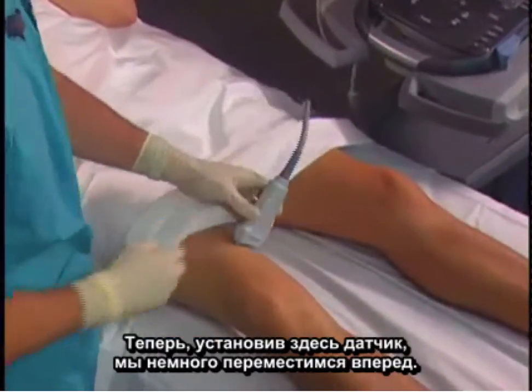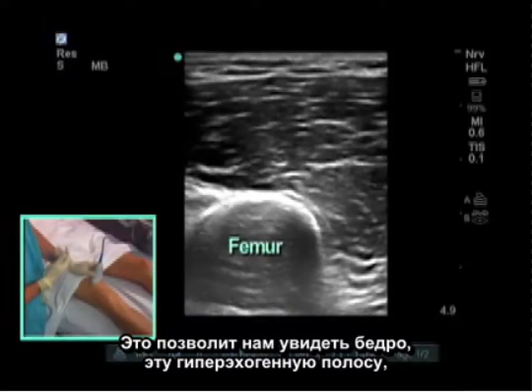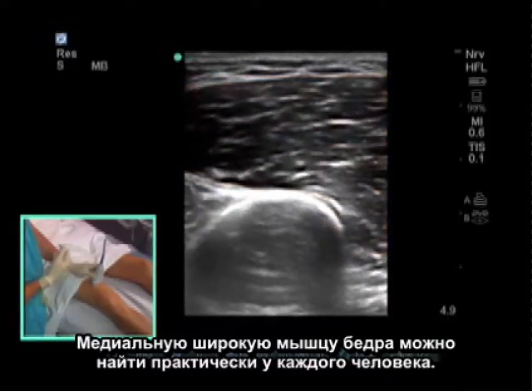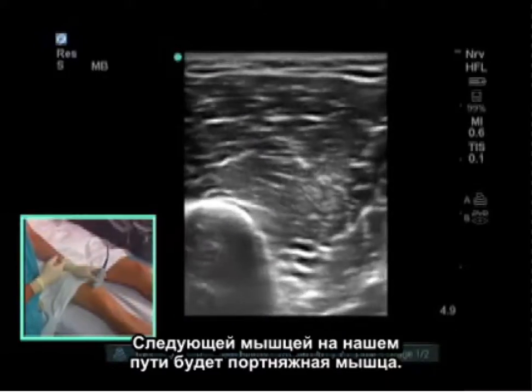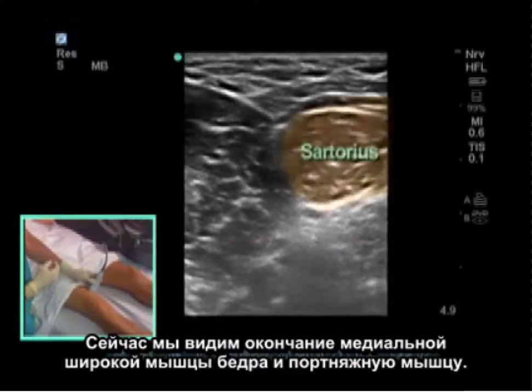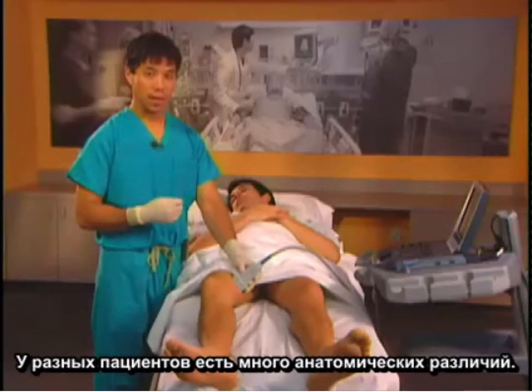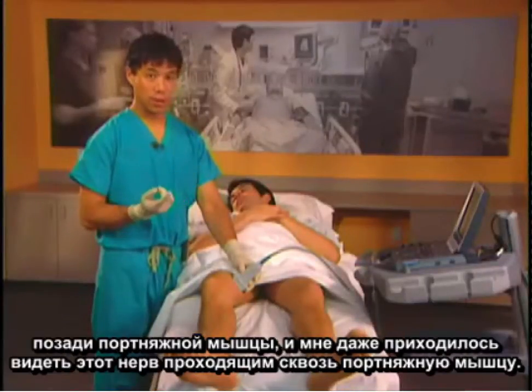When we put the probe on, we like to start more anterior. This gives us a view of the femur — the hyperechoic stripe — as well as the vastus medialis, which can pretty much be found in everybody. We then slide the probe posterior, and the next muscle we come across is the sartorius muscle. There are many anatomical differences patient to patient — the saphenous nerve can run anterior, posterior, or even piercing through the sartorius muscle.